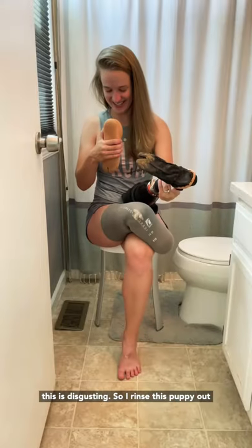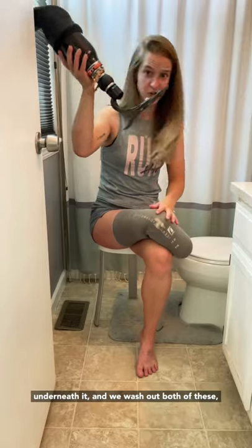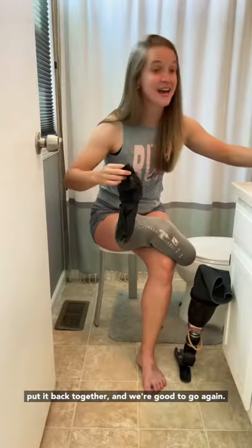Yummy. God, this is disgusting. So I rinse this puppy out, and then we've just got this little raptor claw underneath it. We wash both of these, put it back together, and we're good to go again.